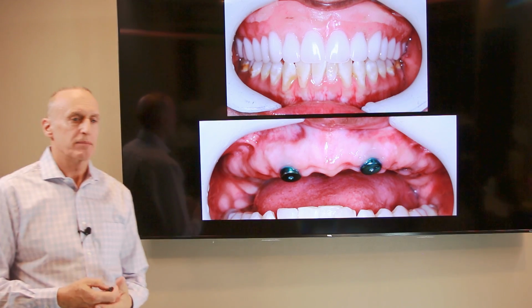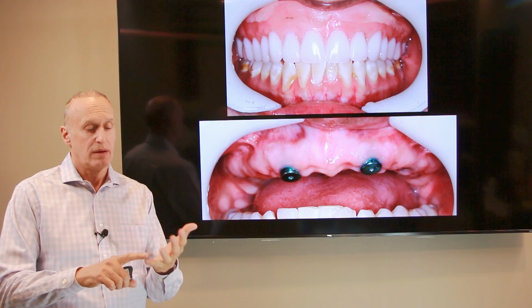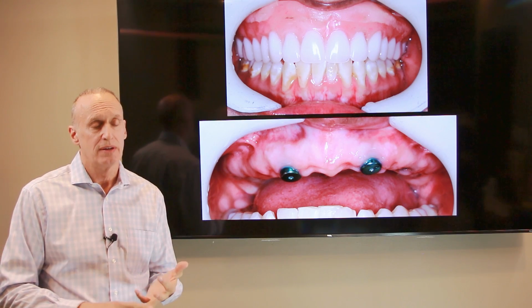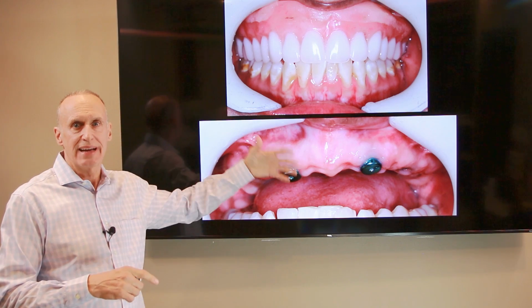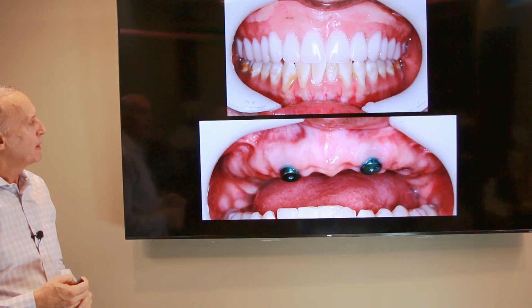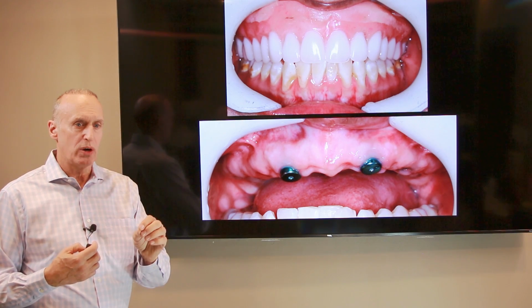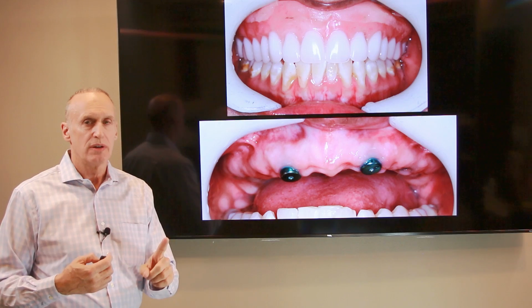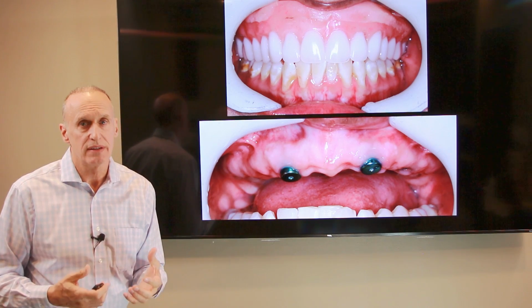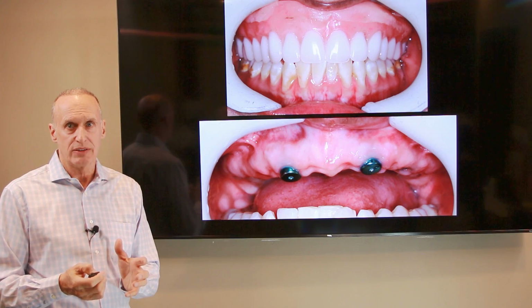So I got to thinking, how can we prevent this problem? One, patients hate temporary dentures. I hate it for the patients. And two, it has a negative impact on the bone and gum tissues. So that's something that is in my control. If you have good bone and good gum tissues and 4, 5, or 6 relatively good teeth that we can use for 2.5 months, you don't have to wear a temporary denture.